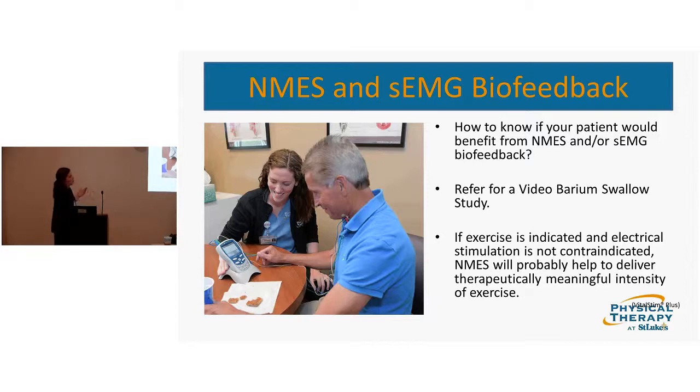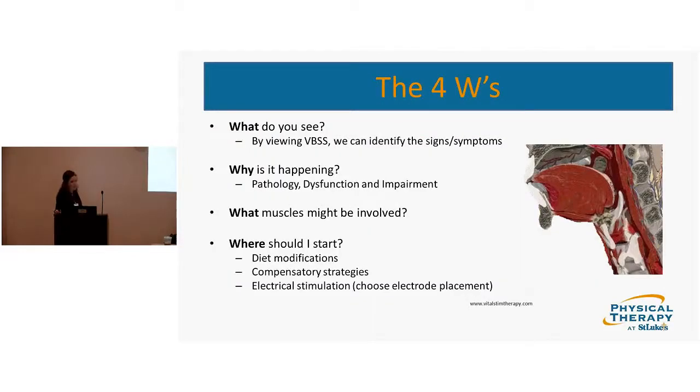So how do you know your patient would benefit from NMES and/or sEMG feedback? Because definitely they can be combined or be two separate things. The first thing, we always want to refer for a video. That's pretty standard when it comes to dysphagia therapy in general, because I want to know what's wrong, why, and what I am trying to target. Is exercise even indicated? Is it going to help at all? The next thing I'd look at is whether there are any contraindications to NMES. If there are not, then jump right in and see if it's going to help us.